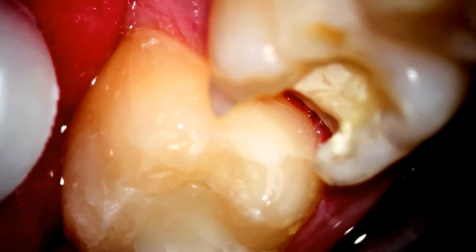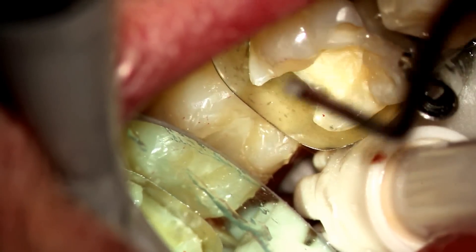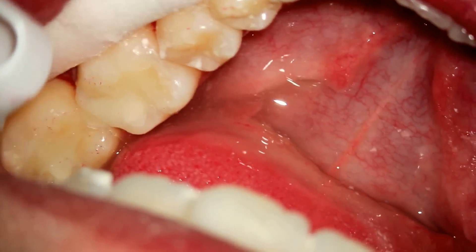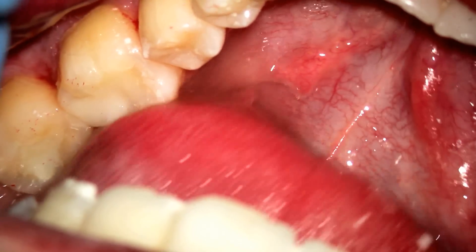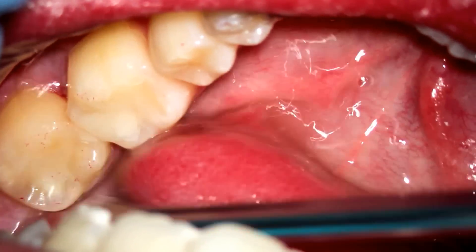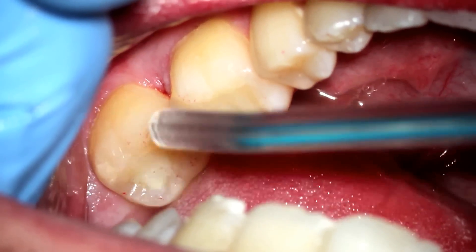Once we put a band around the adjacent tooth — there's the band — notice how there's no blood in that area; everything's cleaned up. We put the filling in, and the fillings are then subsequently polished. I like using polishing discs after I've got the occlusion right. I think that a smoother filling lasts longer and you don't get as much plaque on them. And so there are the two completed fillings.